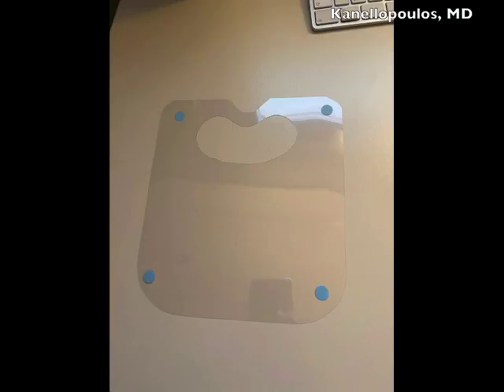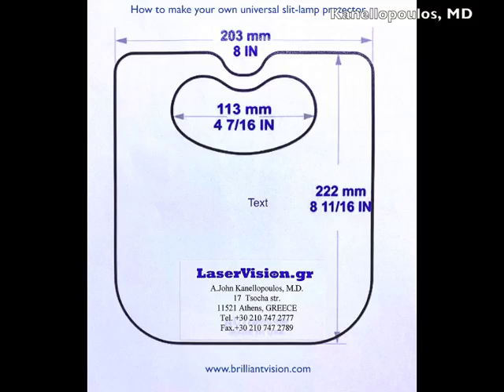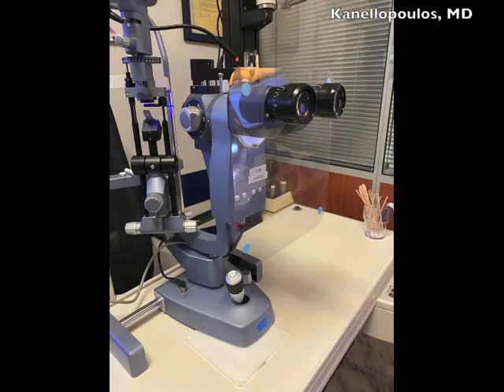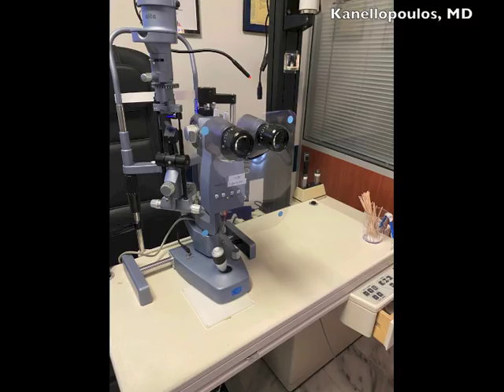All right, so this is what we were trying to make here. The little blue stickers here on the side are just to protect us from bumping into it. And this, as I promised, are the specs in both metric and imperial system, millimeters and inches. And again, this is a little bit smaller than a letter size, and these are the final images of it being placed on the slit lamp. So a very easy way, you can do it within a few minutes, how to protect you and your patients.